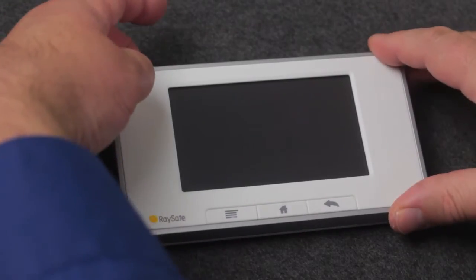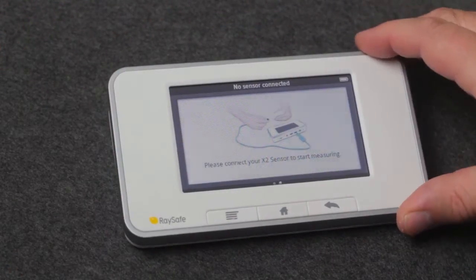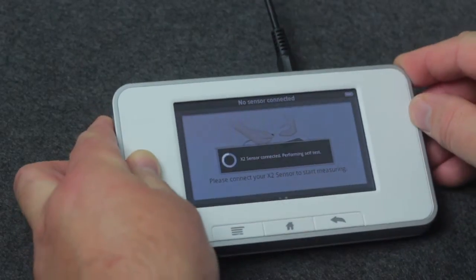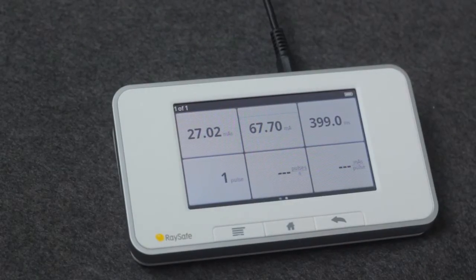First, switch on the base unit. Connect the sensor, make an exposure, and we get the values on the screen.